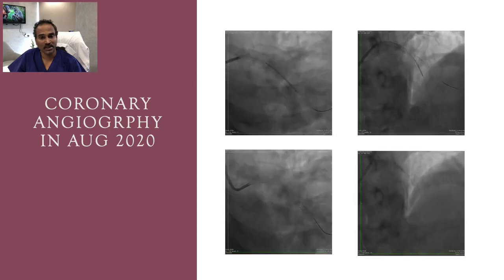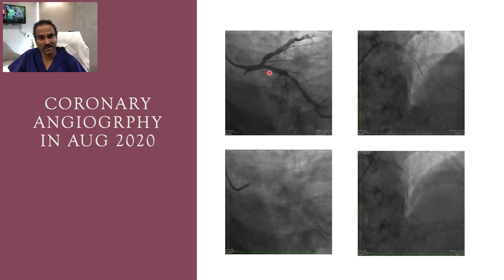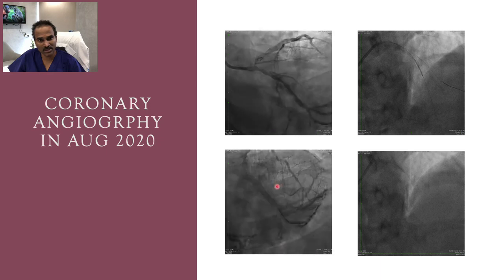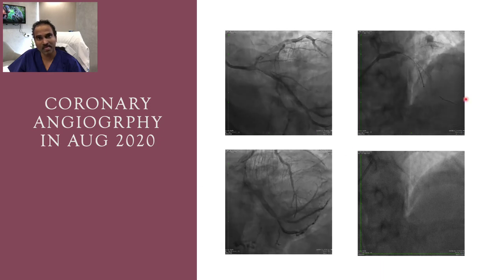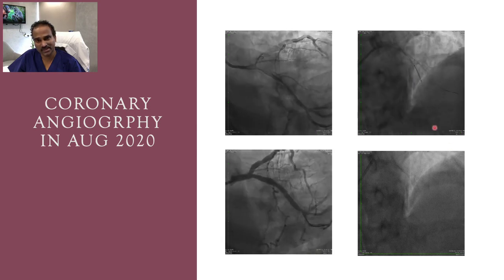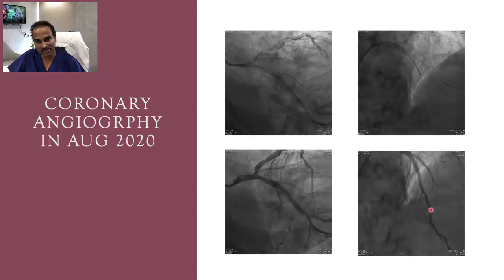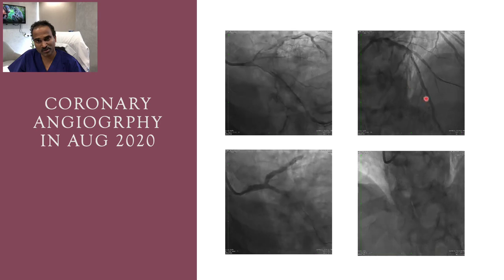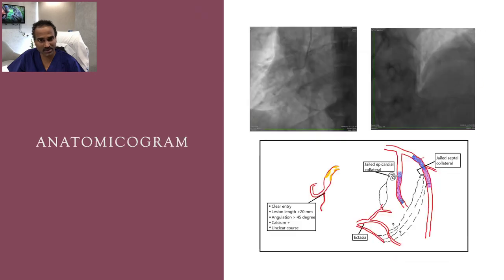So during that acute event, LCX thrombosuction was done and restented with a 3.5 by 28 millimeter stent, and this is the post-stent result, which is quite good. But the two stents jailed the epicardial collateral. And this is the LAD lesion which was pre-dilated and stented with 3 by 15 millimeters with a good result, and septals are also jailed by the two stents.